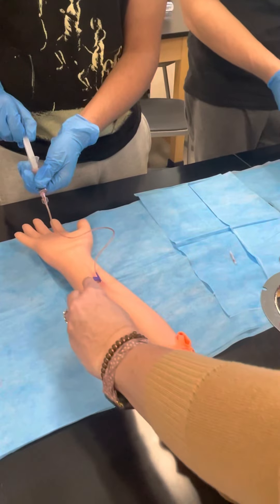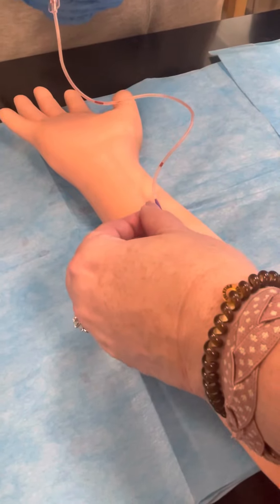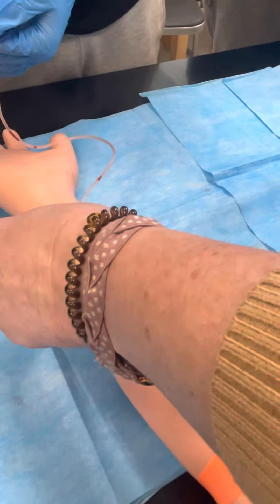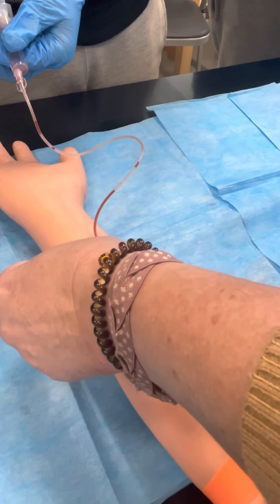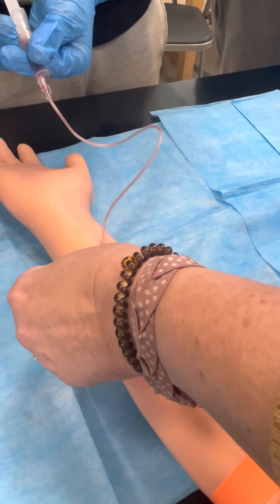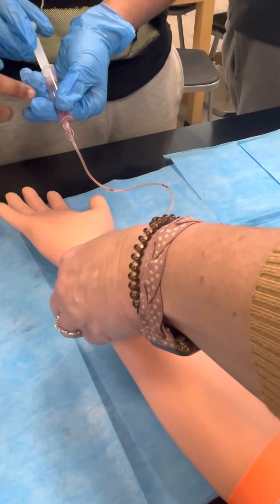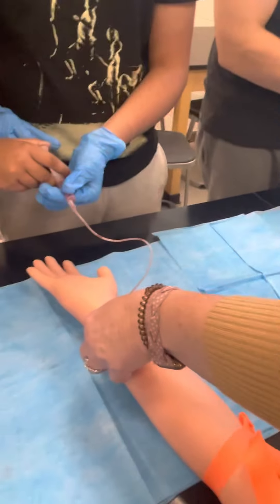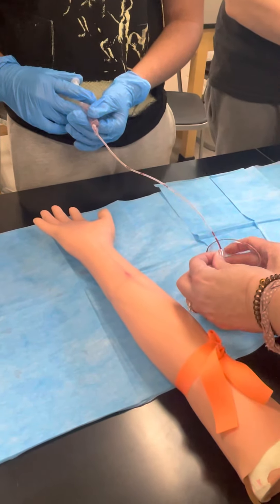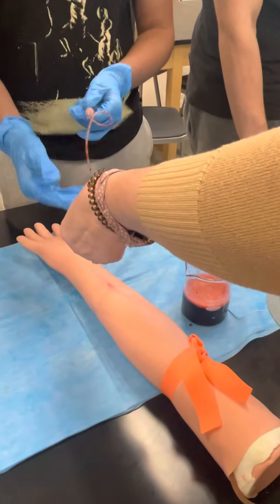This is a good example to catch on video — stop. You went in and I think you're in the right spot, but you went too far — you went in and through. If I pull it back just a tiny bit, now draw back on your syringe. We were pulling air out first, so let's go ahead and take it all out and push it all back in. Try again from the beginning.